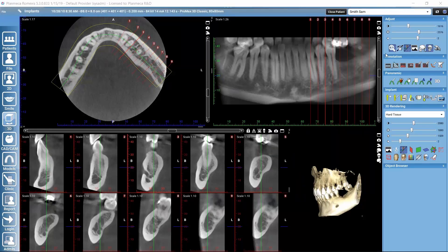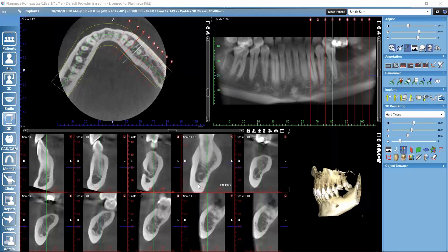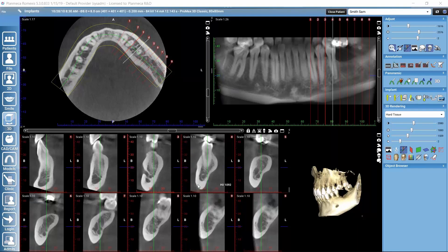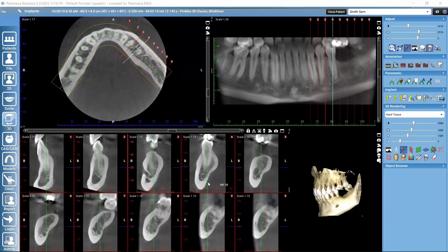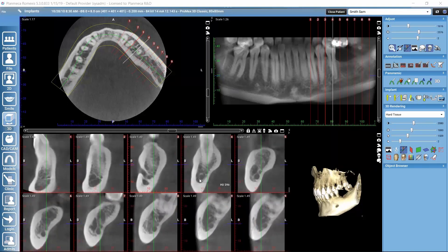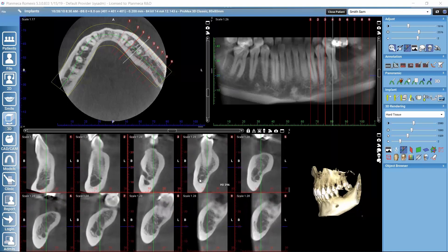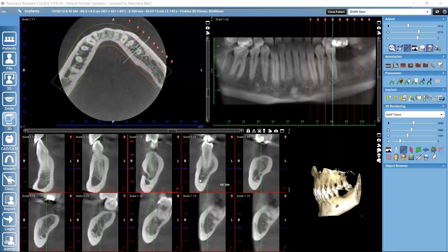With the 'Toggle Zoom' activated, I can use my mouse wheel to zoom in and out of individual views — the part where my cursor is on the slice will be centered during zooming. If I want to zoom all slices simultaneously, I can hold Control on the keyboard and use my mouse wheel to increase or decrease the zoom for all slices at once.